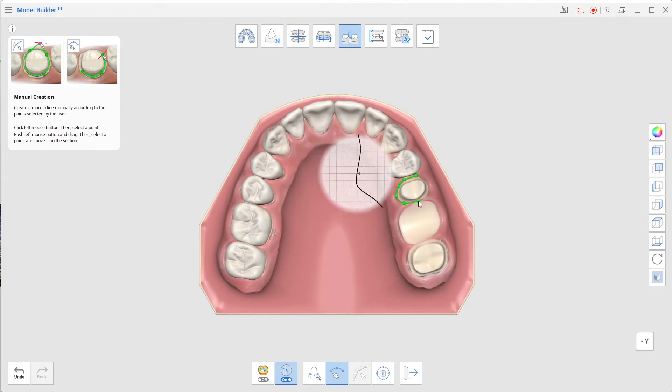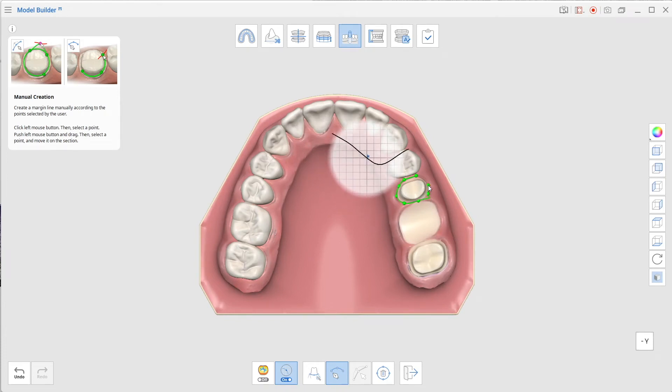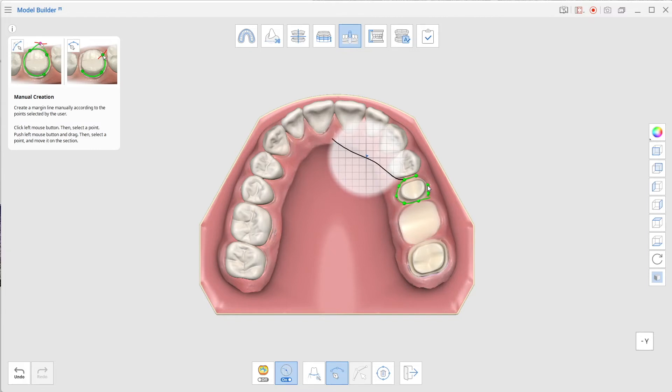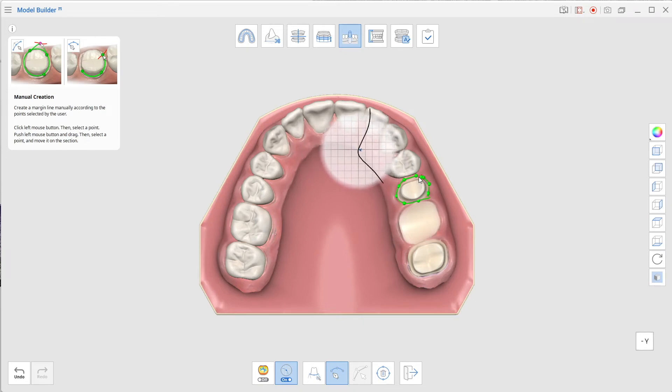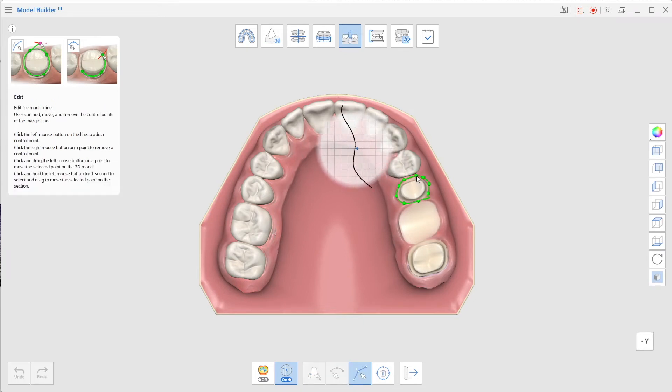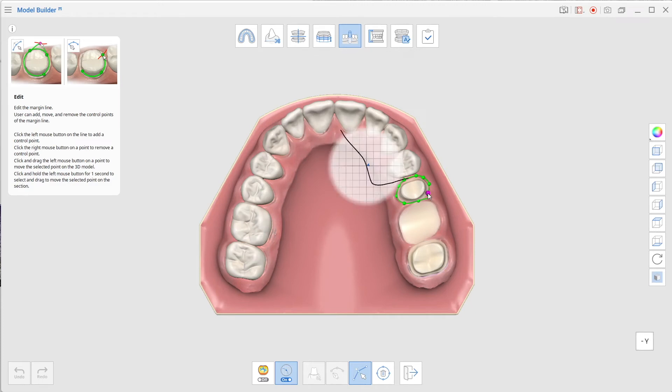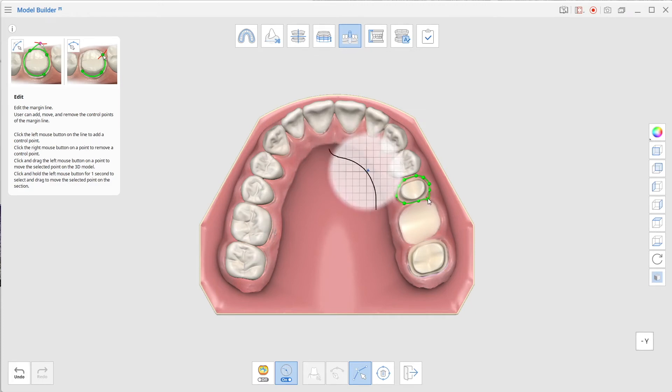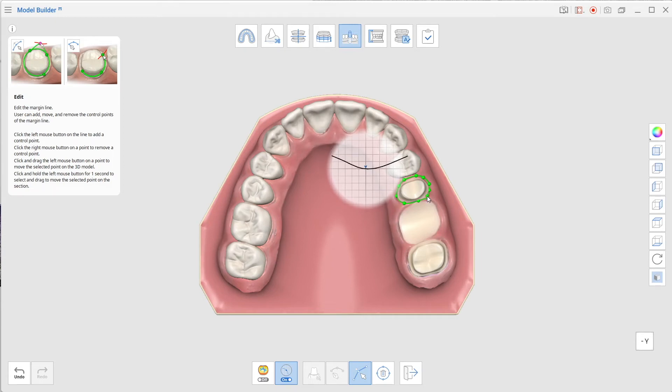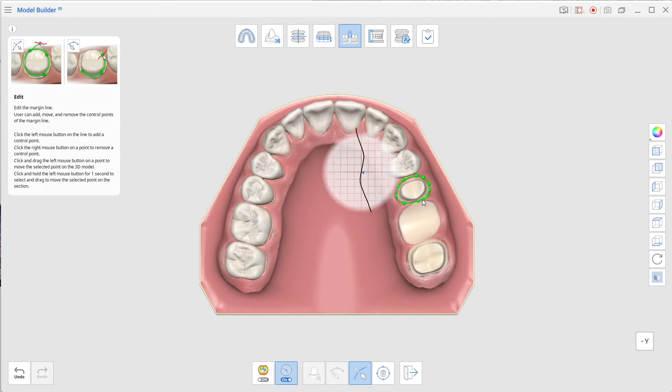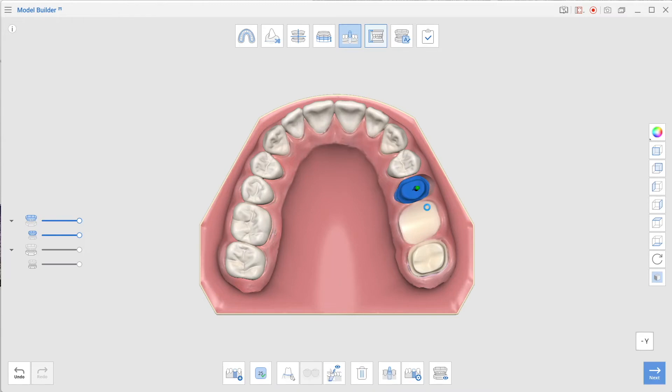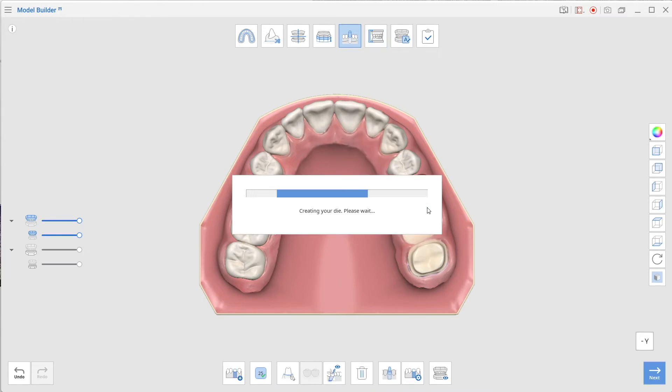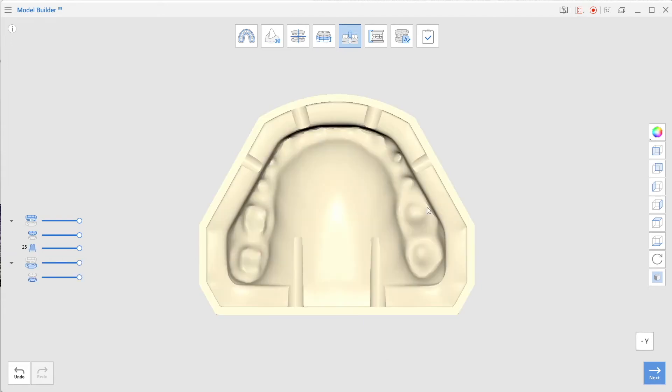I'm going to try and just get through this for the sake of this video as quickly as possible. Once you've made this margin line then we can actually go back to points if we need to, like there where you see here it's just a little bit off. Once we've gone around it's going to take me to that view so I can just adjust things a little bit. I can drag those points, I can add new points, but otherwise I'm pretty happy with that. So once we've selected that area then we can add new points if we want to.